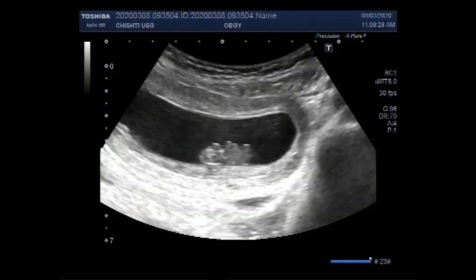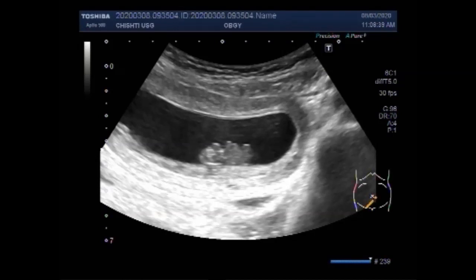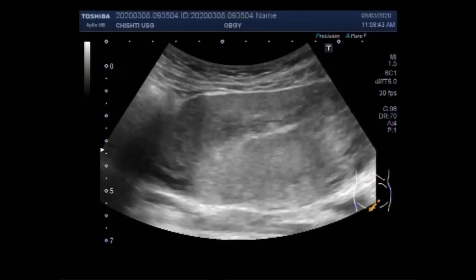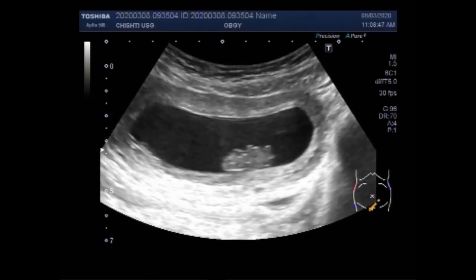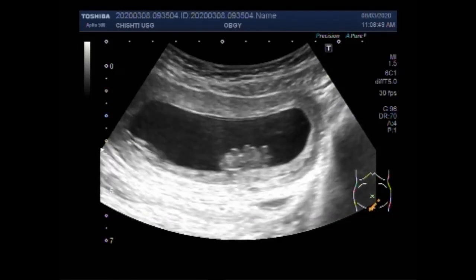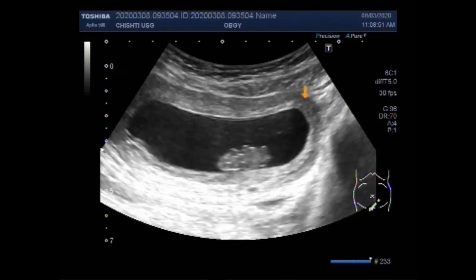This ultrasound video shows a missed abortion or missed miscarriage with fetal demise. Missed miscarriage means that the baby has stopped growing or there is fetal demise, but there are no miscarriage symptoms such as bleeding or pain. It can also be called a delayed miscarriage.